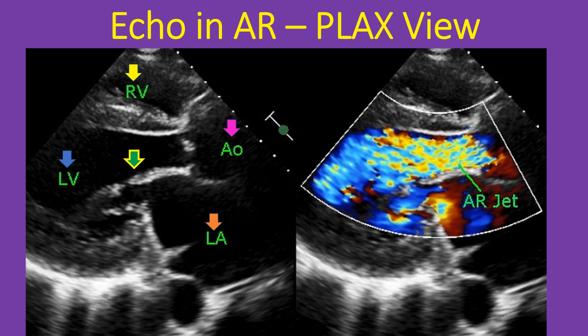Mitral valve leaflets seen in open position between the left ventricle and left atrium are thickened. The large aortic regurgitation jet can be seen as a mosaic jet in the left ventricular outflow tract, anterior to the anterior mitral leaflet. A portion of the thickened aortic valve can be seen between the aorta and the left ventricle. The AR jet is almost filling the left ventricular outflow tract and extends well into the left ventricle beyond the anterior mitral leaflet, indicating free aortic regurgitation.